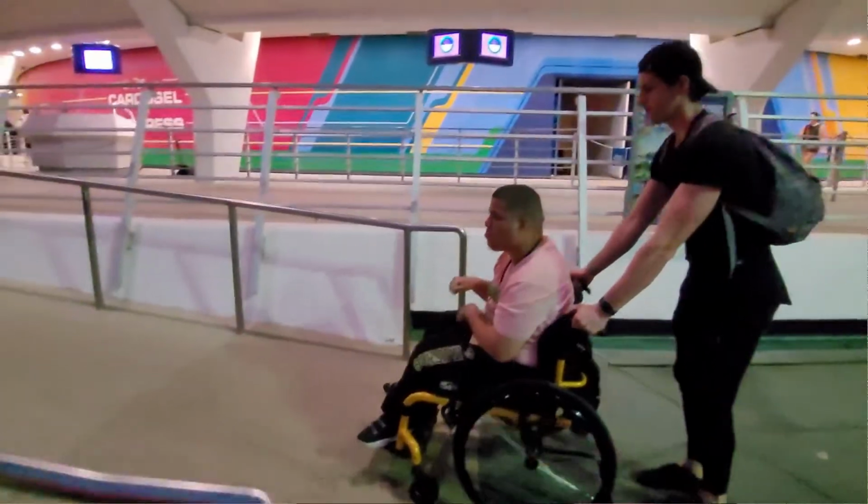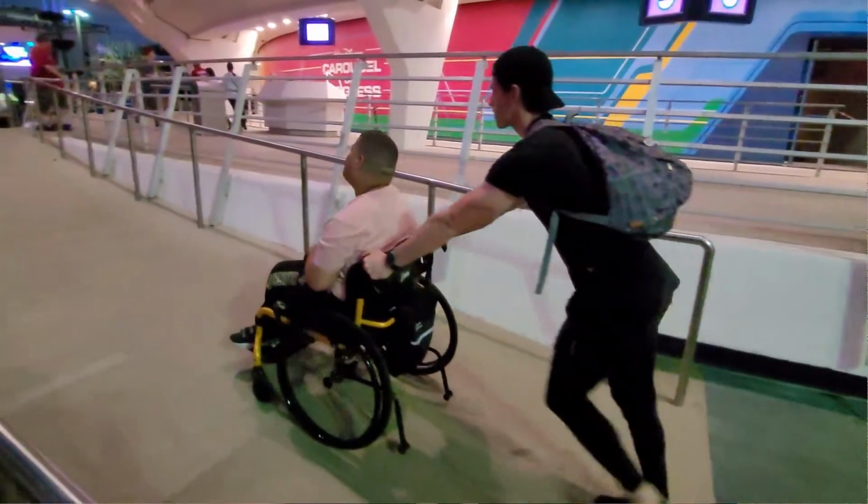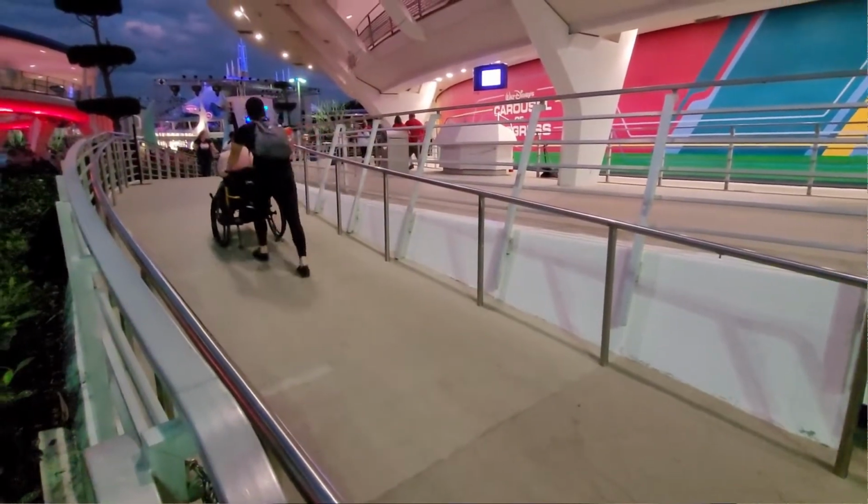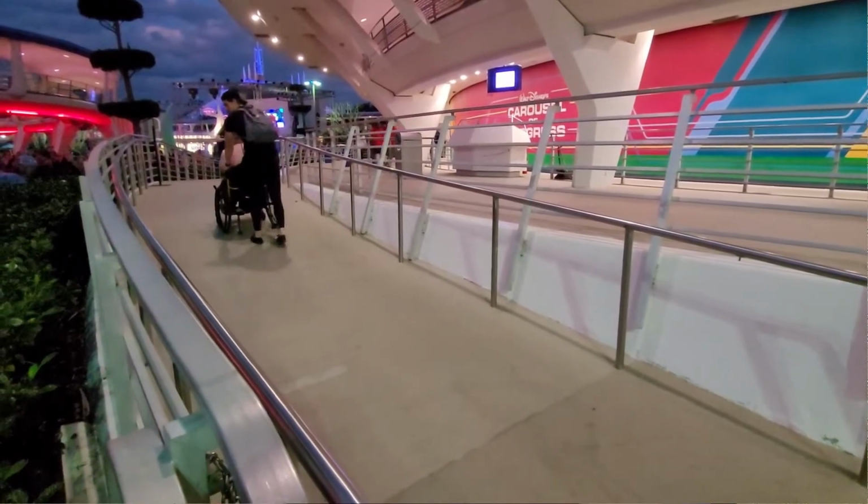So going uphill, pretty straightforward. You just want to push them uphill. However, we want to make sure that we're doing it with proper form. So what you want to think about is first pushing your hips back and then keeping your chest up nice and tall. And we really want to push through the legs in order to push them up the hill. We don't really want to be trying to force it with our arms. Our arms should really be locked in and stable.